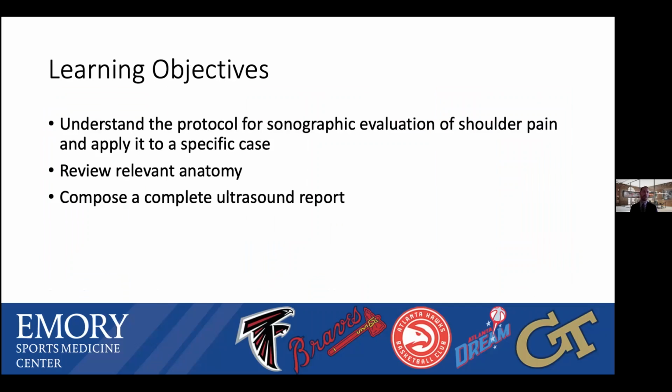So our objectives for today is to really go over that sonographic protocol for the shoulder, and then we'll apply it to this case. And as we go through, I'll review the relevant anatomy, and we'll break it down by sections to eventually come up with this full ultrasound report.